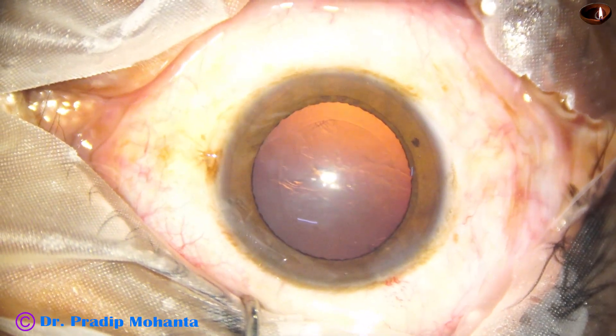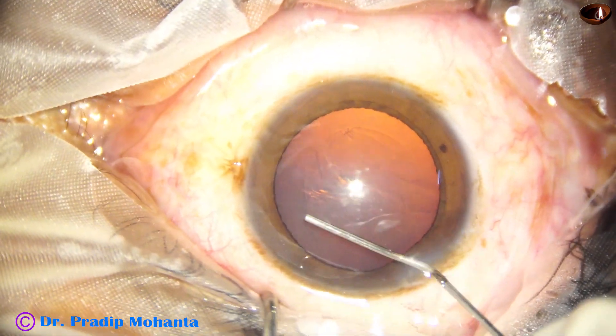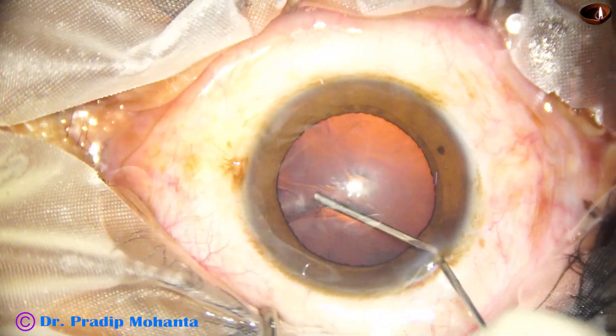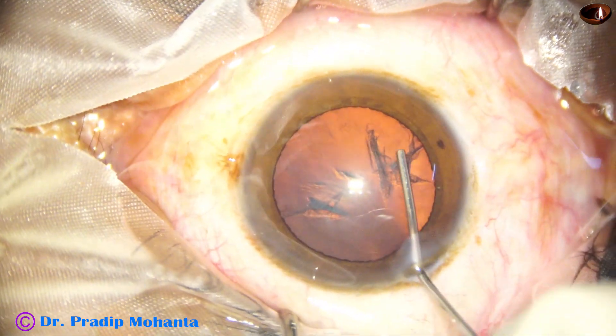And now is the time to do hydrodissection. A 27-gauge cannula is used to do hydrodissection. The fluid wave goes from one side to the other side, then another fluid wave.